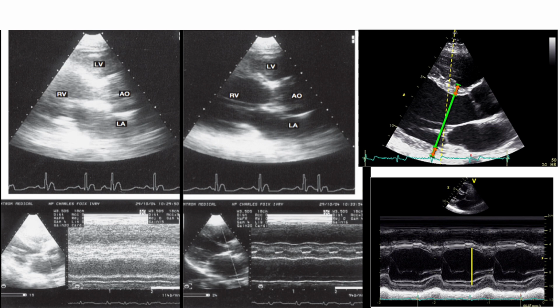The generated M-mode from this image is fuzzy, and you cannot take your measurements from here. But with just very simple and directed image optimization, in the image in the middle, you can take your measurements. And finally, with good image optimization and patient positioning, you can take very accurate measurements, as you are seeing on the image on the right side.